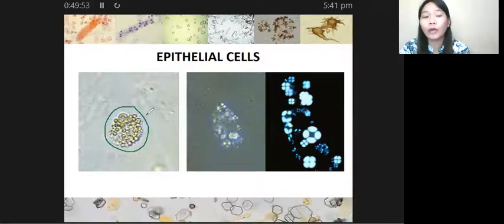Okay, so again, if you are not sure whether it is an oval fat body or a bubble cell, you have to view it under your polarizing microscope. Okay, so actually, wag ito. Kasi ano yan, fatty cast yan actually. Okay, so ito siya. Ayan. So as you can see there, you have yung ating tinatawag na Maltese cross formation.